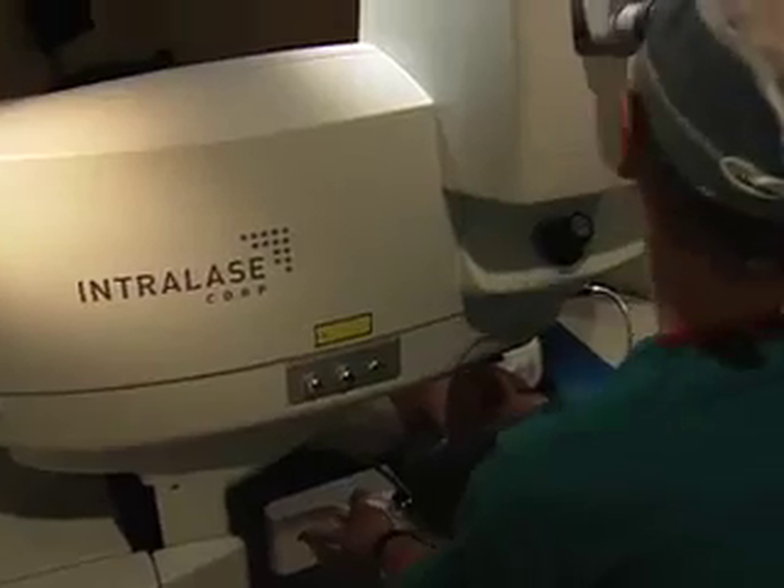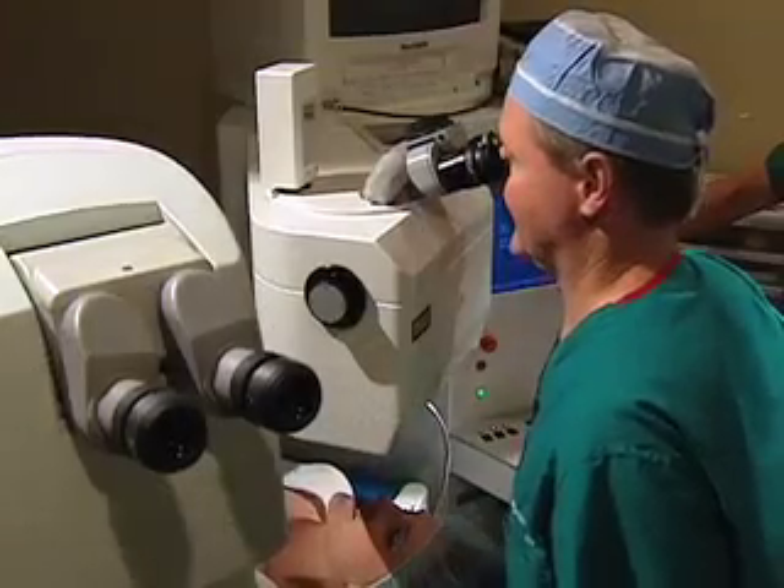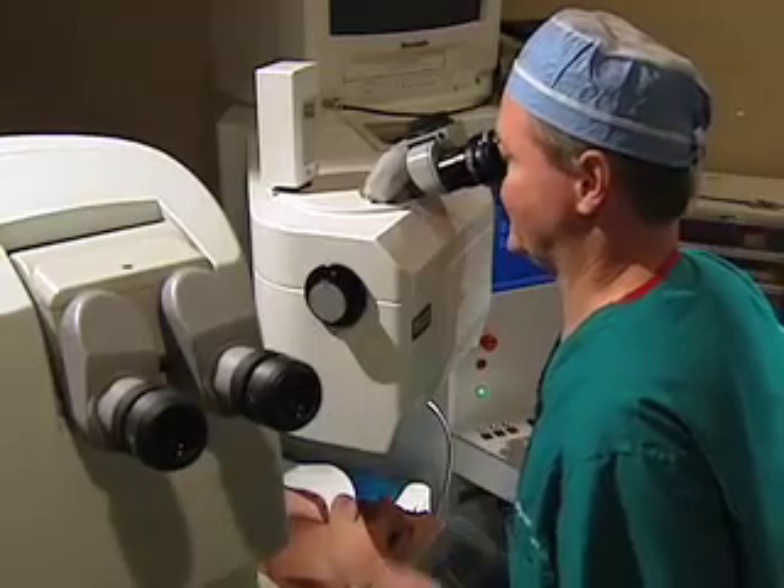then we proceed with the Bausch and Lohm laser to actually put your prescription on your eye. The small flap that was created with the intralase device is opened, and then the excimer laser — the Bausch and Lohm laser — is used to take away your prescription. On average, that takes anywhere from 15 to 30 seconds. Then the flap is closed, everything is rinsed, and we move on to the other eye. The whole procedure takes about 10 to 15 minutes. It's fairly quick.